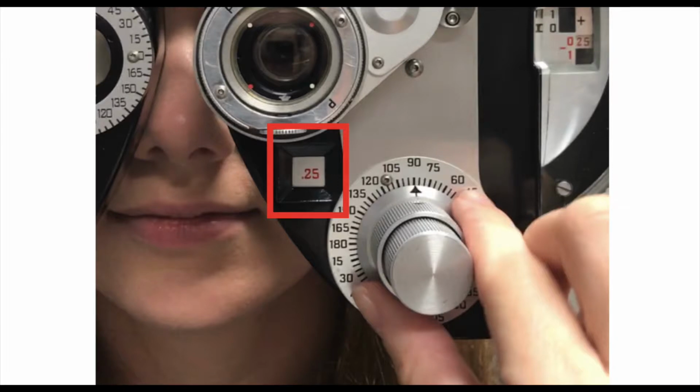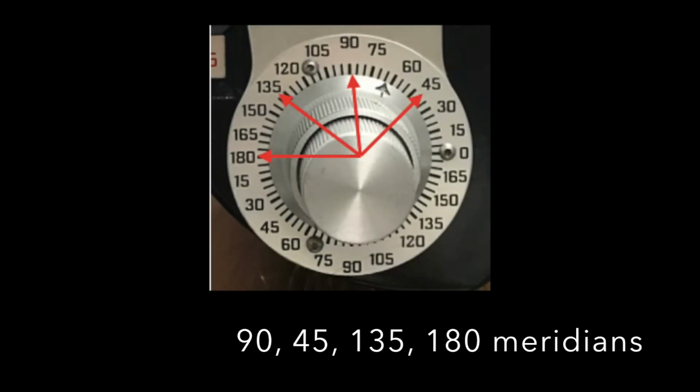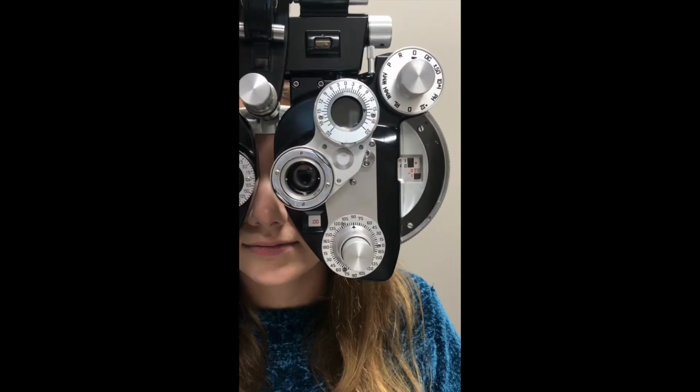Power acceptance starts the procedure by seeing if the cylinder power is even wanted by the patient. The first step in power acceptance mode is to insert 0.25 diopter cylinder and test the acceptance in the 90, 45, 135, and 180 degree meridians. If the patient accepts the power in any of the meridians, go to step number 2, axis refinement mode. We are ready to begin.